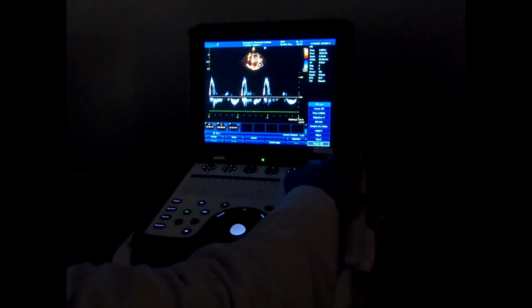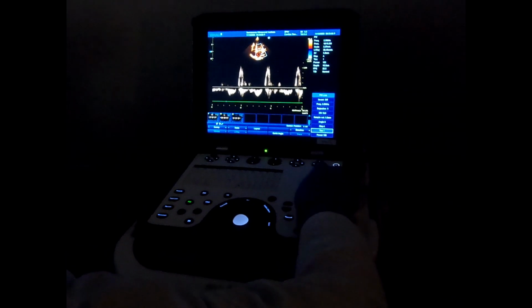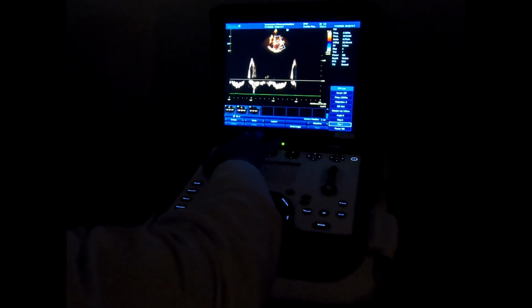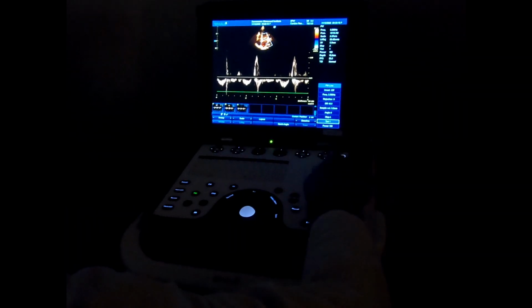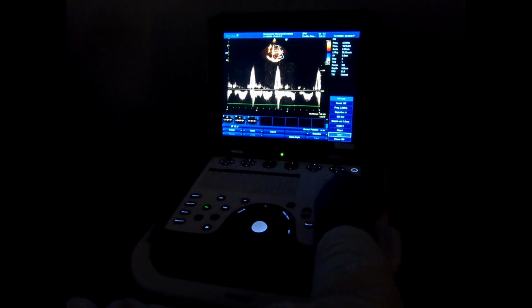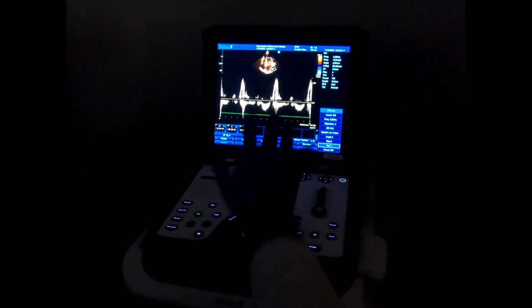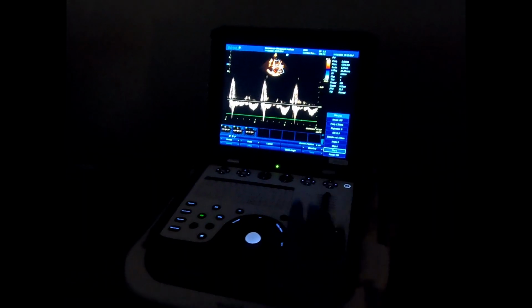And you can make it look better, you can even change the tint here. See, it is based on the sweep speed. That was too fast, though. Yeah, include three at least. So there is so much room to do a lot of things. Do you want a background, or without background?